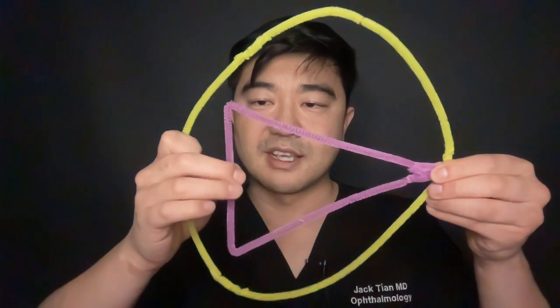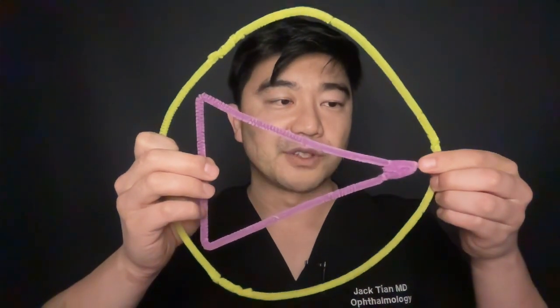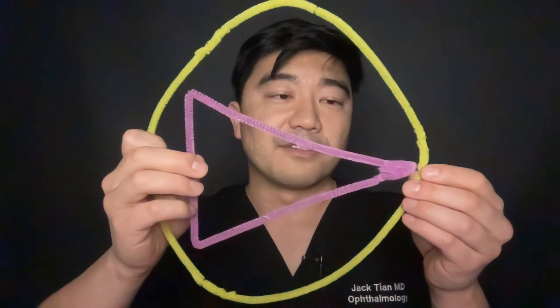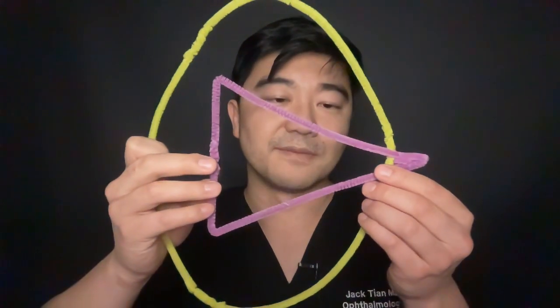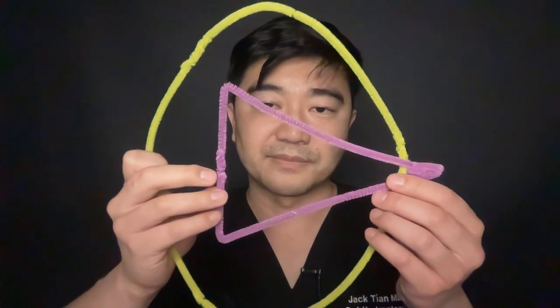So if the lens settles slightly anterior, then you see the focus is in front of the retina. This will lead to a myopic shift, which means the patient will be nearsighted. If the focal point or the focus of the lens is behind the retina, the patient is hyperopic or farsighted.